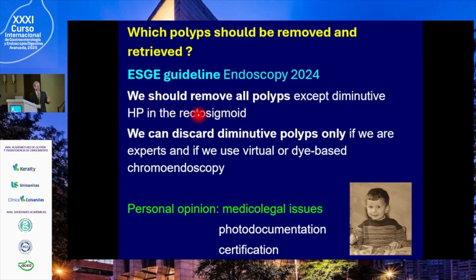Do you agree, Montserrat? Yes. Then we can discard diminutive polyps only if we are expert and if we use virtual or dye-based chromoendoscopy. Diminutive polyp can be adenomatous, of course, but the risk of cancer is very limited. Yes, we can, but only if you are an expert, Montserrat. If you are not an expert, no.